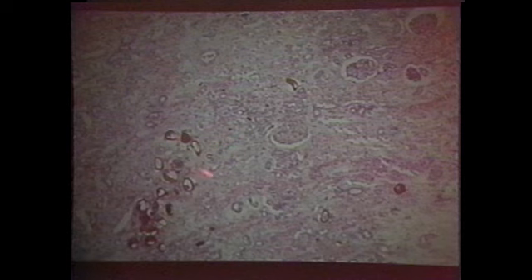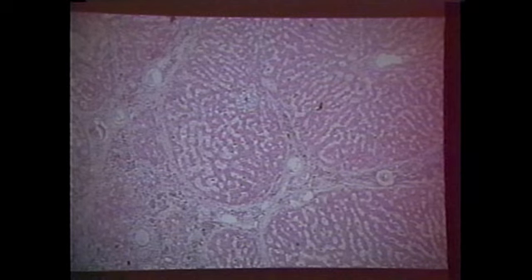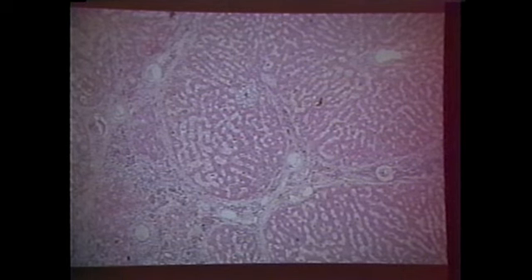You see these brown eggs all in the parenchyma of this turtle? And here, this is the schistosome that occurs in the United States, and that's Heterobilharzia. It is not Schistosoma. There are other genera of these things as well.